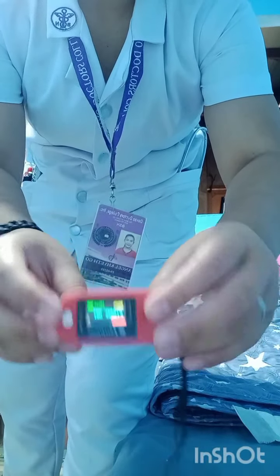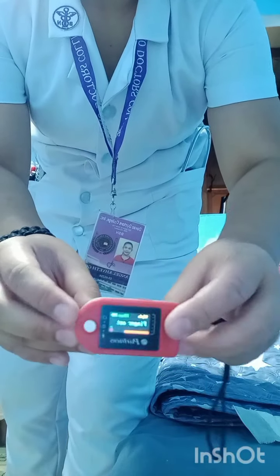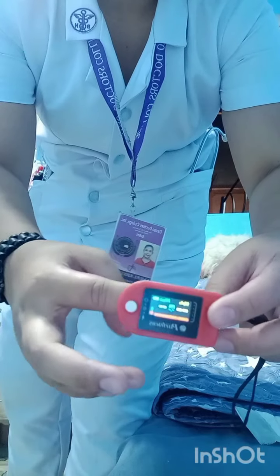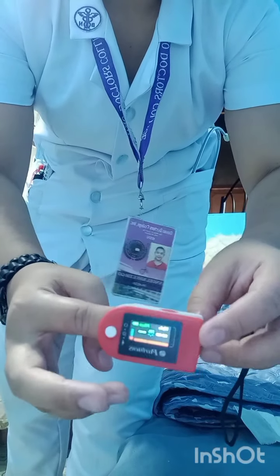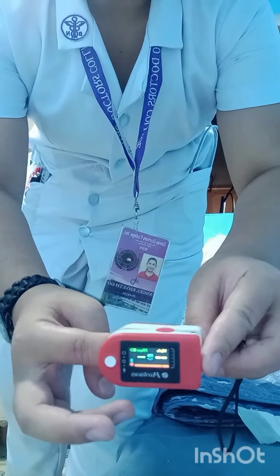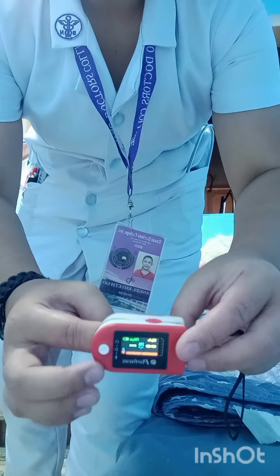Sa paggamit naman ng pulse oximeter, kagaya nito, you're just going to push this one, and then you're going to put your finger here, or the finger of your client, and then babasa na siya kung ilan yung oxygen level tsaka heart rate ng patient na dito na nakalagay.